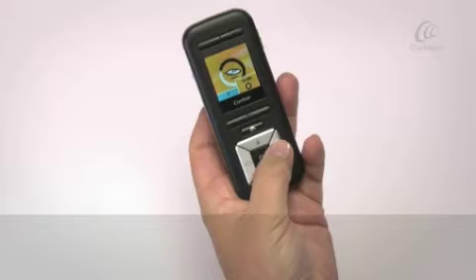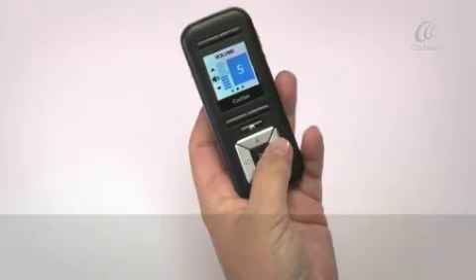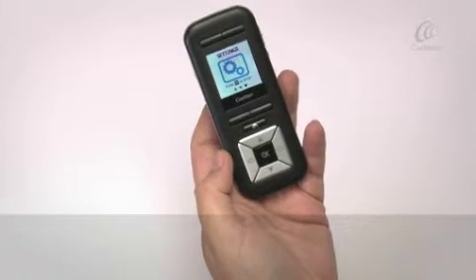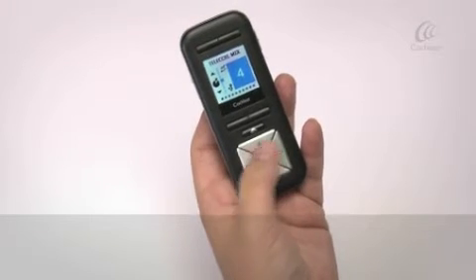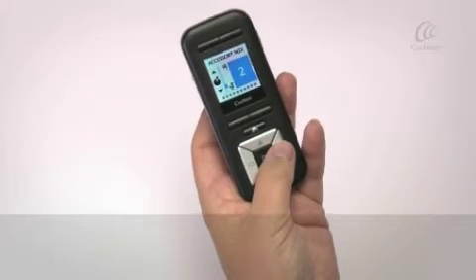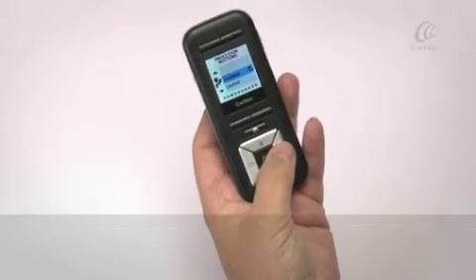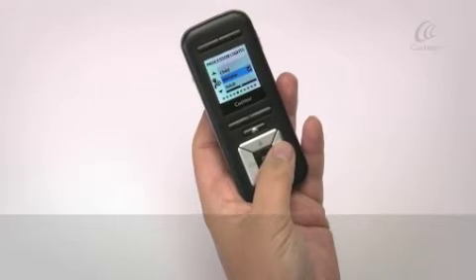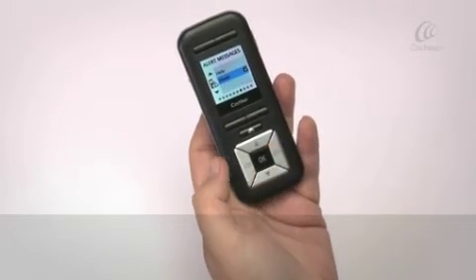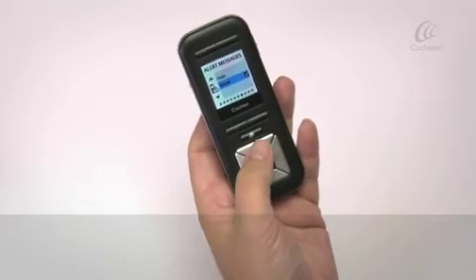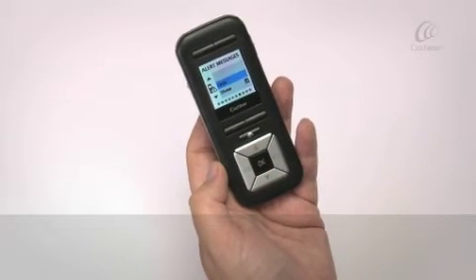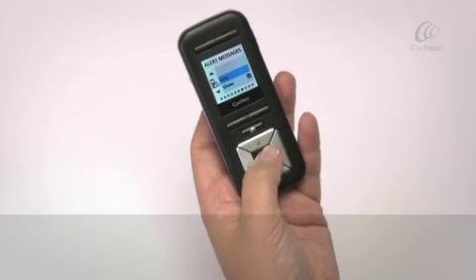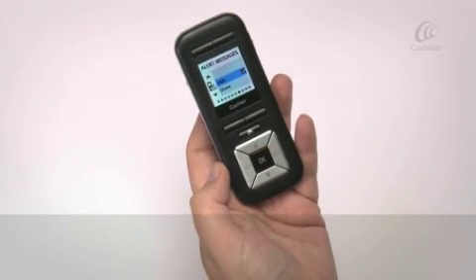Go to the settings screen and press the OK button. Press the right arrow button to navigate to the alert messages screen. Press the up or down arrow button to highlight hide or show. Press the OK button to select.